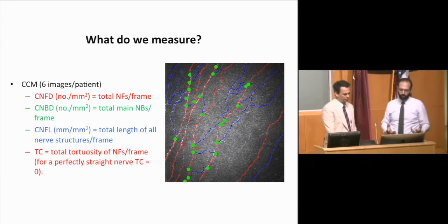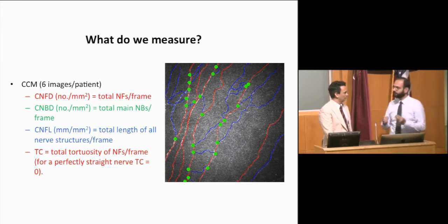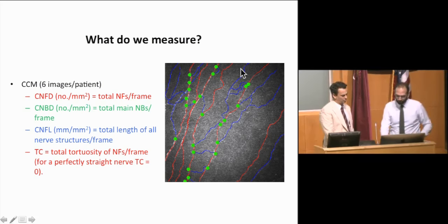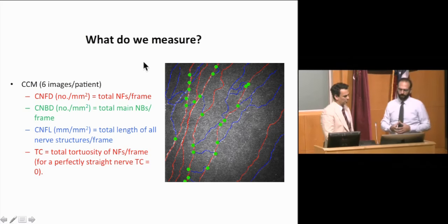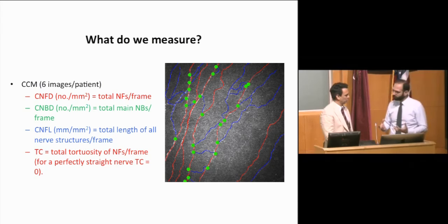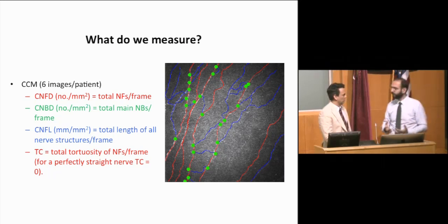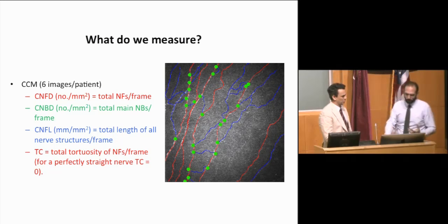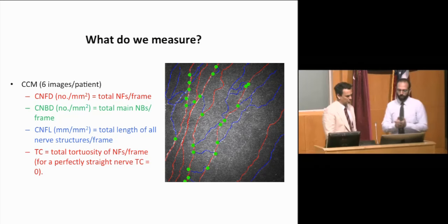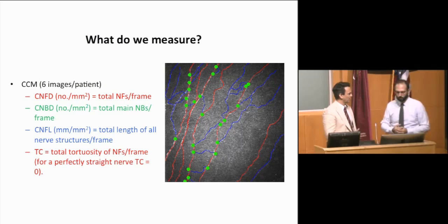Then we have corneal nerve branch density, which refers to the total number of nerve branches, that is main nerve branches, in the frame. Then is corneal nerve fiber length, which is the sum of the length of all nerve structures in the image, and that is branches and fibers. And finally, the tortuosity coefficient, that is a feature specific for nerve fibers. A perfectly straight nerve would equal a tortuosity of zero, and tortuosity goes up as the nerve deviates from a straight line. The higher the number, the more tortuous, and it goes up to infinity.